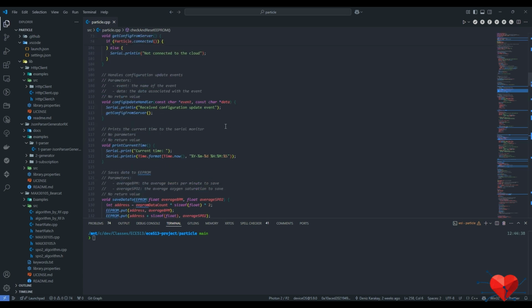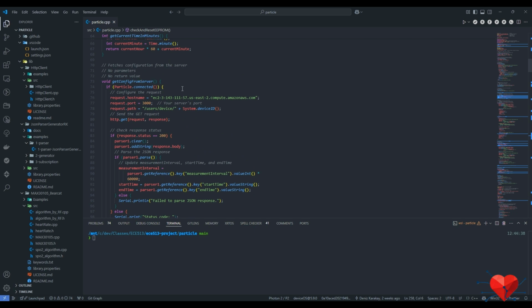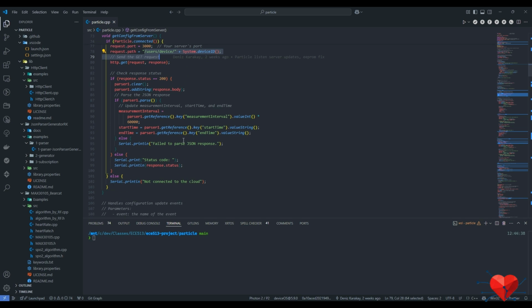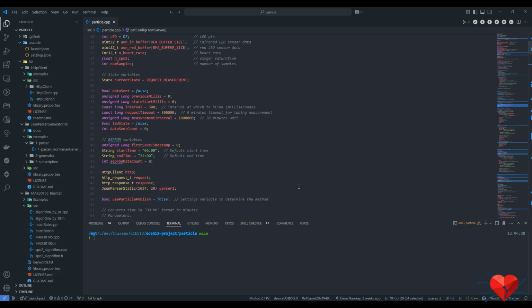Apart from that, we utilize the config from the server function. So we are reading the data from the user's device. We are actually reading the device ID that's on the particle, and we are getting the measurement interval and start and end times, and we are updating those based on the things on the server.